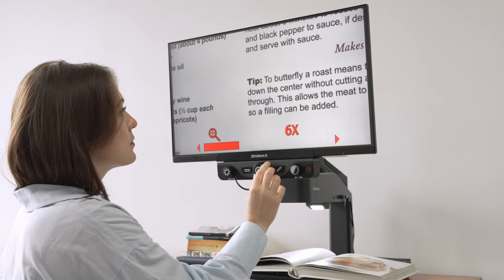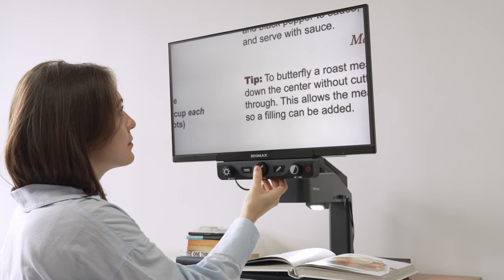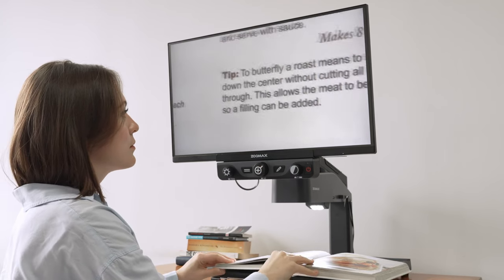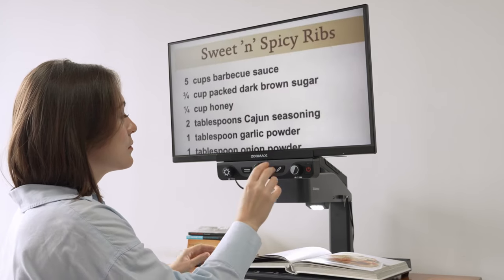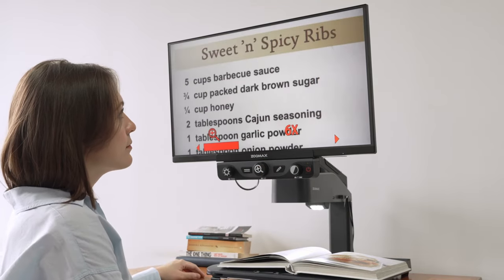Then start your reading journey. If you want to set your favorite magnification memory, press and hold the zoom button. When your favorite magnification is set, short-press the zoom button at any magnification level and it will bring you back to your favorite magnification.